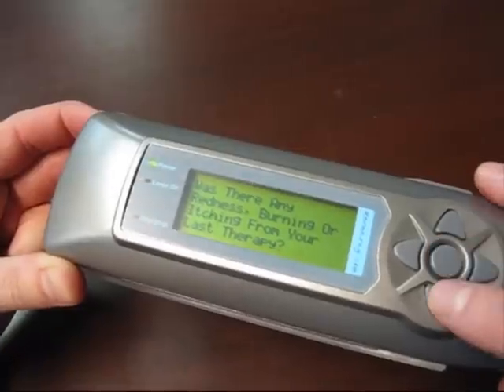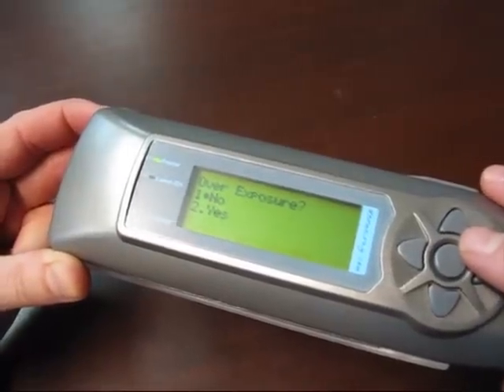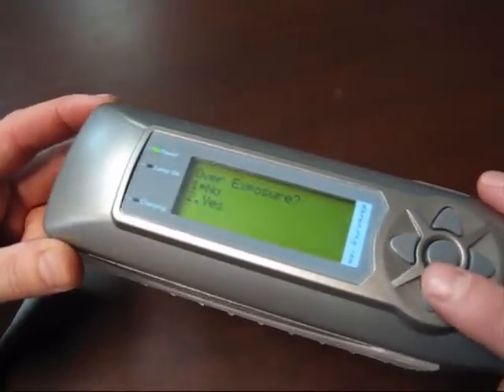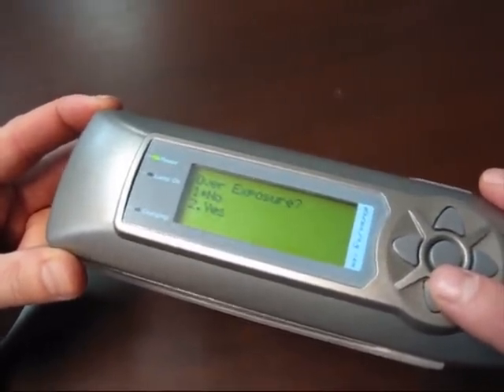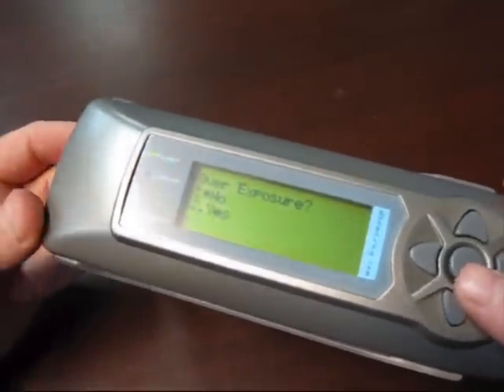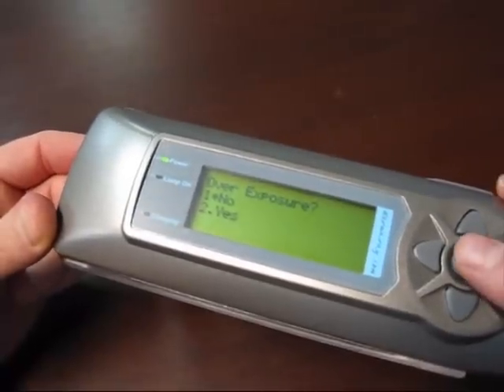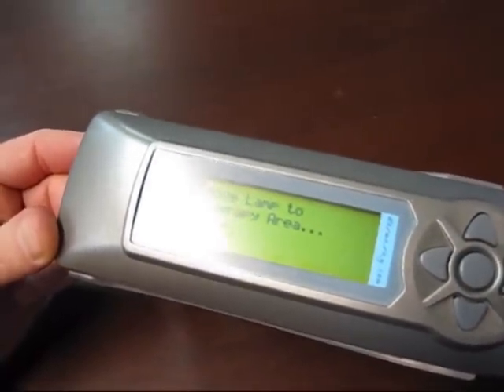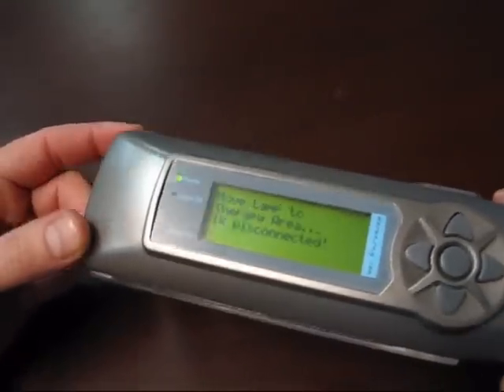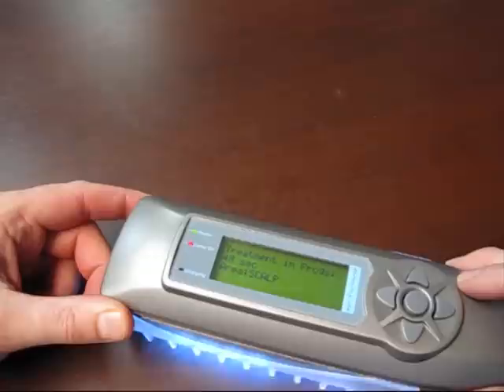So to answer that question, was there any burning or redness? If you select yes, your next treatment will be reduced to lessen the chance of burning. If there wasn't, it means it was a satisfactory level of treatment for you, so you can pick no. It's now going to increase the next treatment time up to the safe maximum for your skin type.